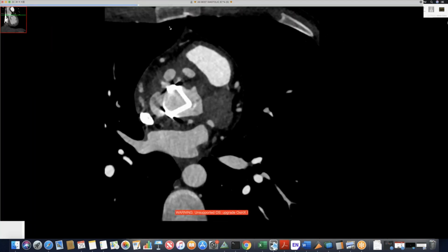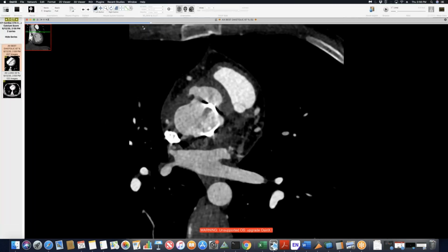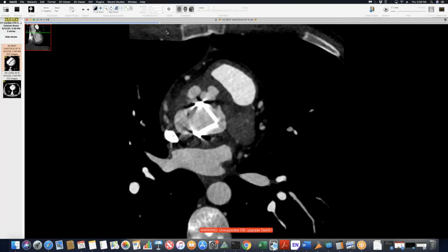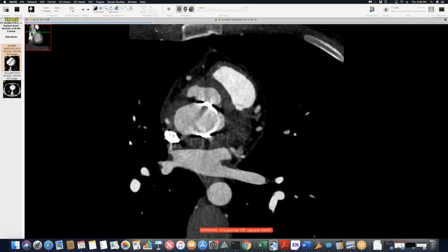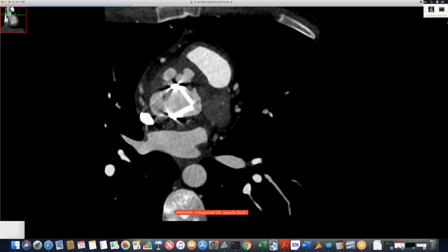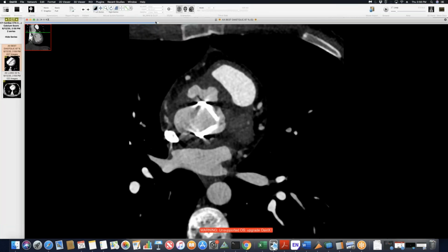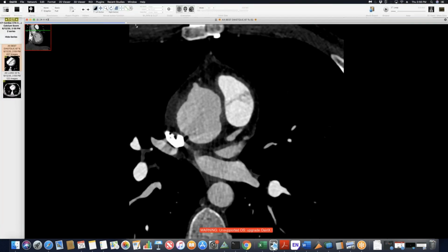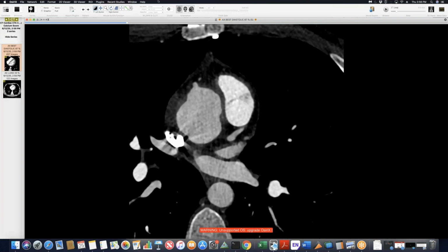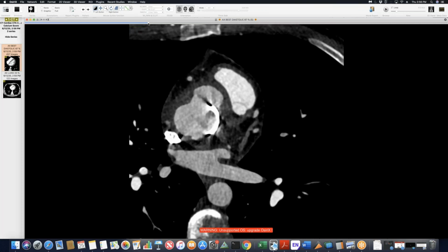They did do blood cultures, and those were all negative. I don't think he had a white count when he came in, but I was very concerned about an infection of the aortic root, and called these abscess cavities. And then you can just see all this soft tissue that's growing around here. So it's basically abscess phlegmon with abscess cavities. And the biggest one, so this is the RCA right here in the front. As we go inferior to the RCA, you can see this outpouching just drooping down.